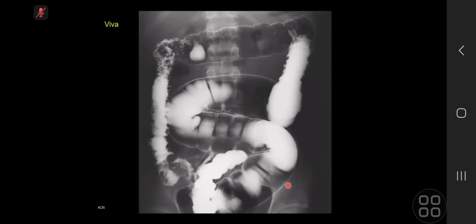There is quite marked thumbprinting in the ascending colon. There are also some filling defects seen in the ascending and proximal transverse colon, the splenic flexure as well, and also in the proximal descending colon.